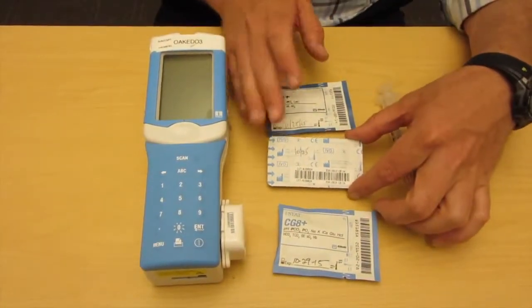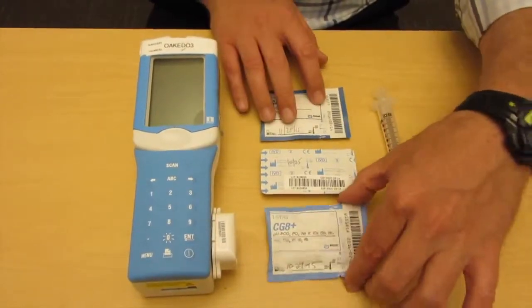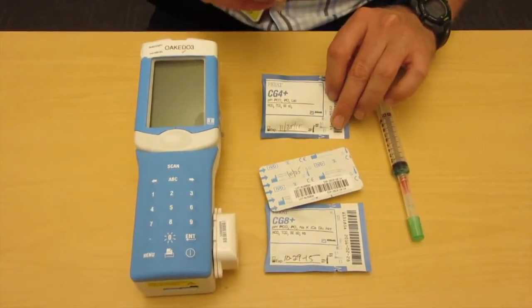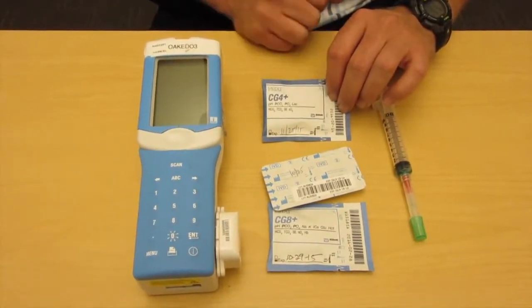We have a troponin cartridge — these are used very, very infrequently, but they can give us a troponin within 10 minutes. The CG4 and CG8 cartridge give a full result within 120 seconds or two minutes. The CG4 is almost exclusively used for the lactic acid that it gives us within two minutes for screening for sepsis.